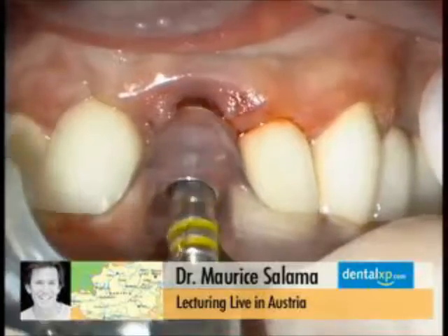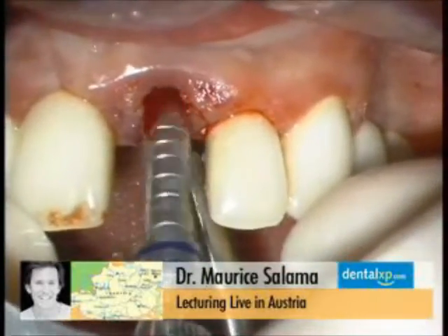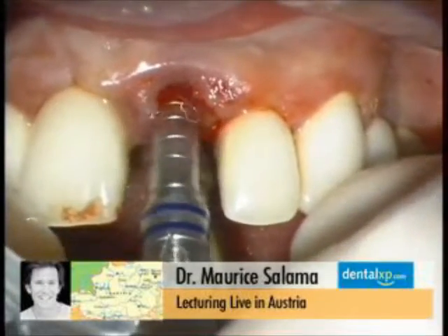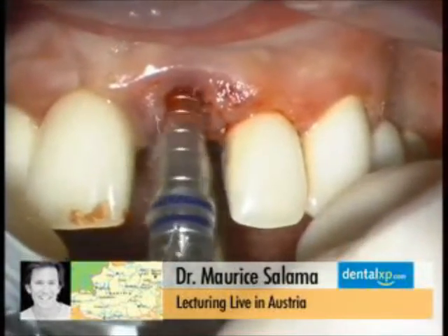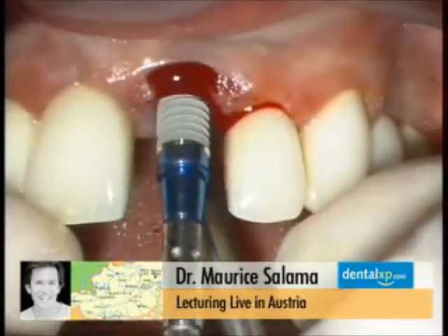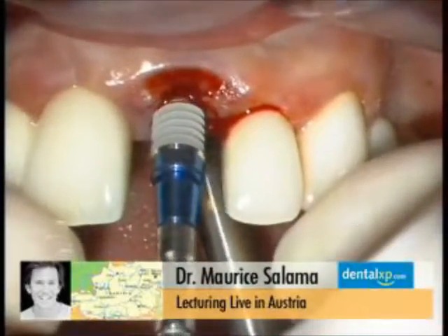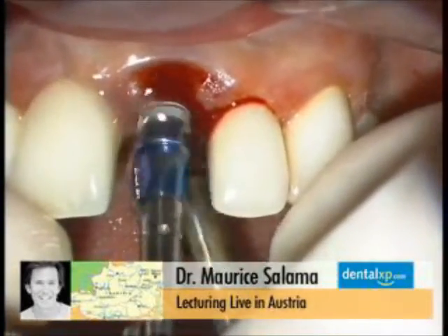We went ahead in this case and we used allograft bone, a little bit of excitement in this case because we can't always get autogenous bone from our patients or they won't let us do a donor site. In this case we utilized a J-block from Tutogen. We hydrated this for 2 10-minute saline baths and we went ahead and decorticated it.